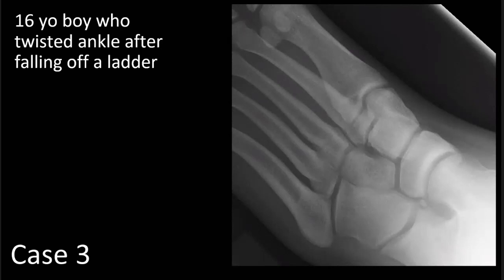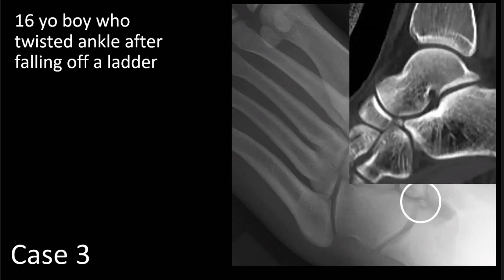Our next case is a 16-year-old boy who twisted his ankle after falling off a ladder. On this cone-down oblique view of the midfoot, we see a small bony density projecting over the space between the talus, calcaneus, cuboid, and navicular. On the reconstructed sagittal CT image, we again see the small bony density in that space between the four bones, most closely approximated to the anterior process of the calcaneus. The margin of the anterior process of the calcaneus is well-corticated, so we can deduce this bony density most likely represents an accessory ossicle.